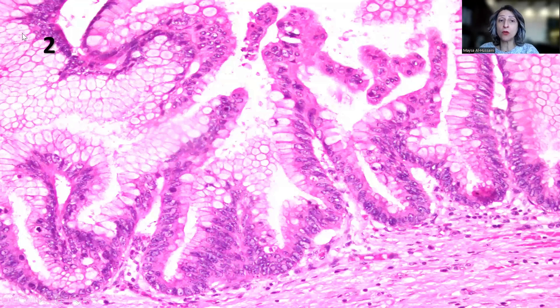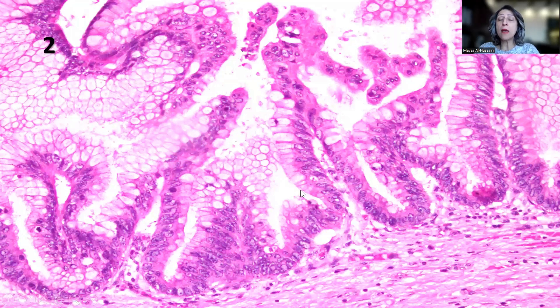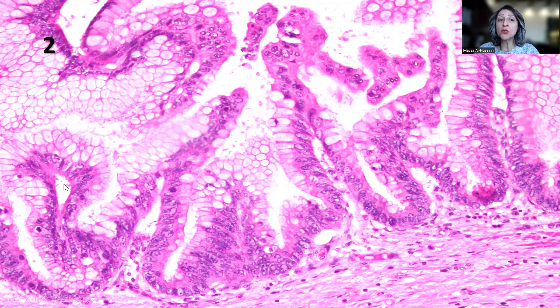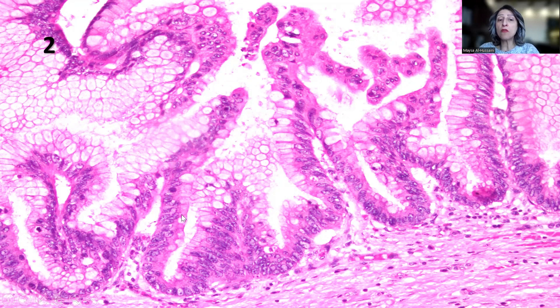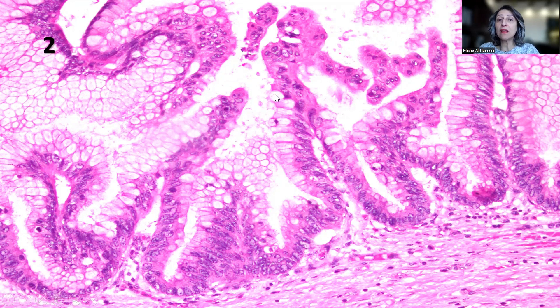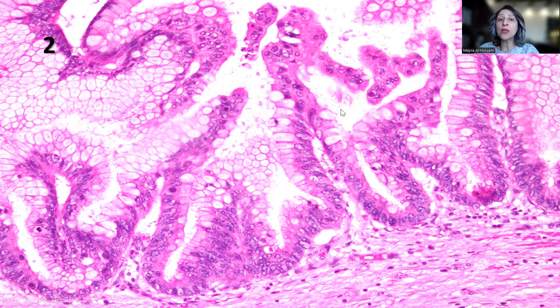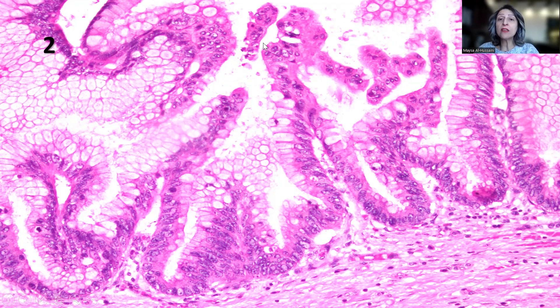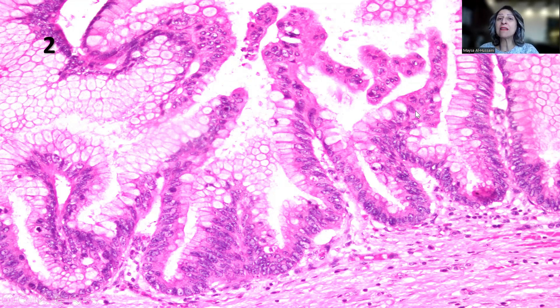This is another focus from the main pancreatic duct, where we have this villous proliferation lined by high-grade dysplasia, showing here some oncocytic changes in the cytoplasm — again, another important clue to the diagnosis.